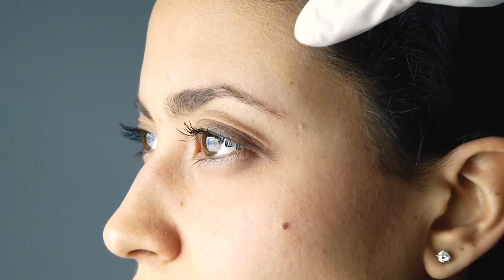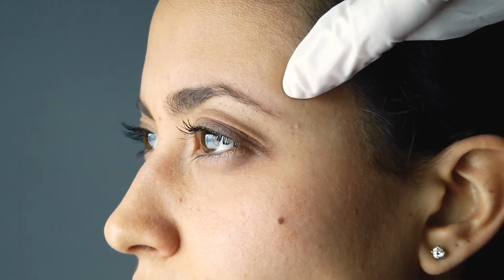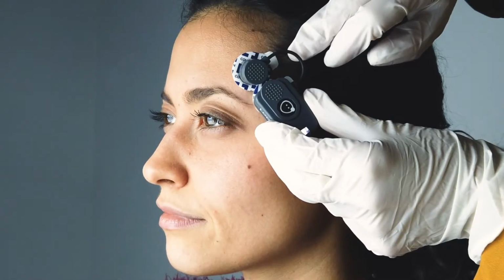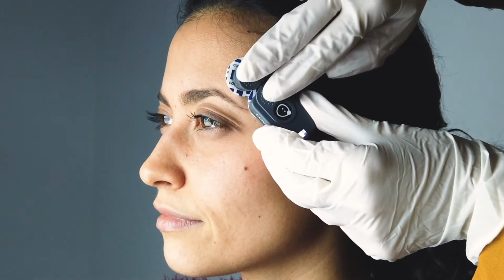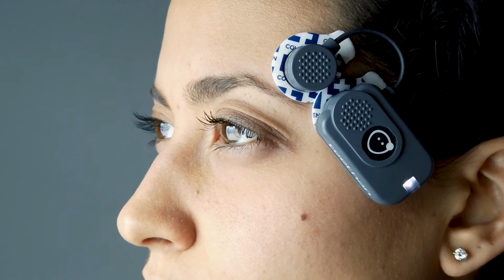To detect the temporalis anterior, palpate the muscle and ask the patient to clench. Identify the major axis of the zygomatic process of the frontal bone and apply the probe along the anterior margin of the muscle near the coronal suture, keeping 2 centimeters from the zygomatic process.